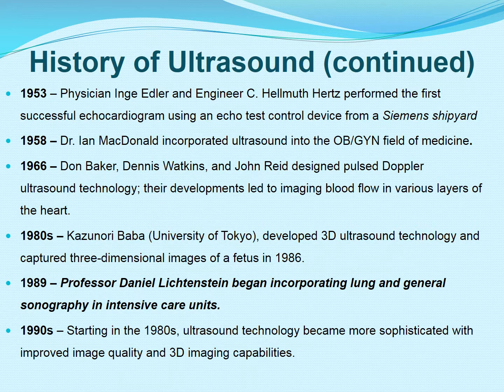When compared to using chest x-rays as the traditional pneumonia assessment in the ICU, ultrasound showed to be significant because Professor Daniel Lichtenstein was able to treat his patient with pneumonia successfully using the ultrasonography diagnostic tool compared to that of chest x-rays.